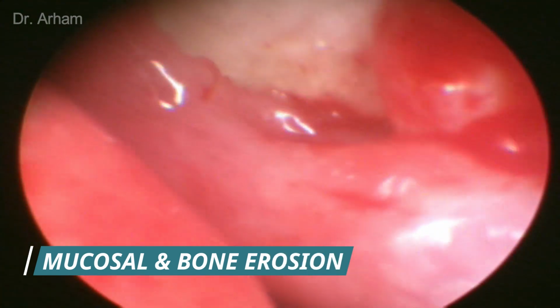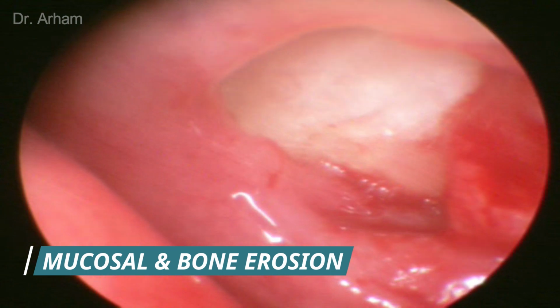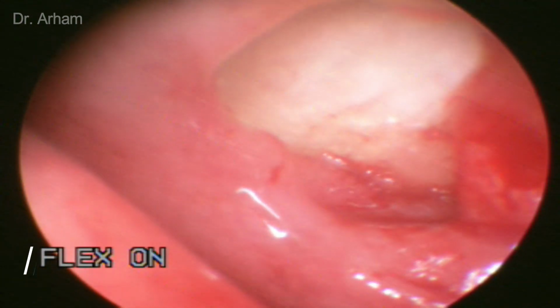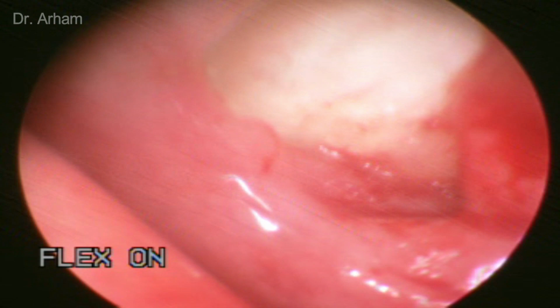I'll show you this in the videos where I had seen the patients in the initial stage. You will see that mucosal erosion is there. When I remove the mucormycosis endoscopically, you will find the erosion of mucosa. The mucosa is not there. The bare bone is there. So there is bone destruction. This is in the early stages.